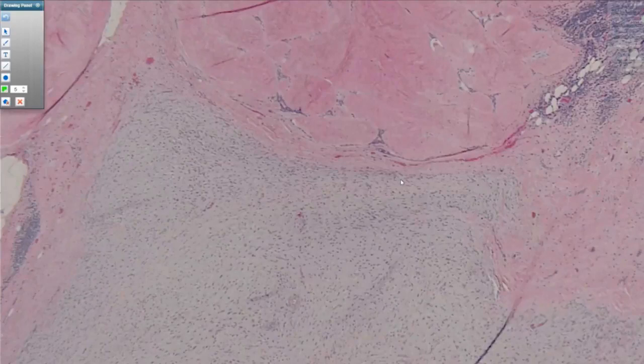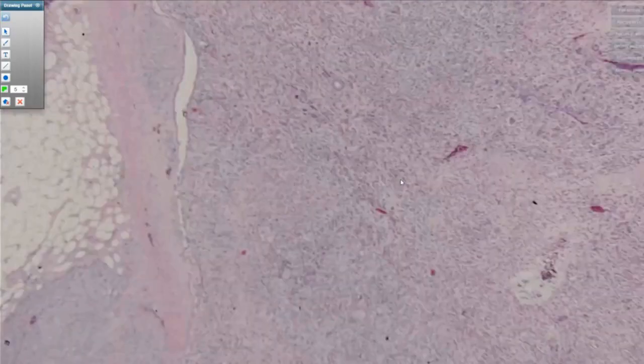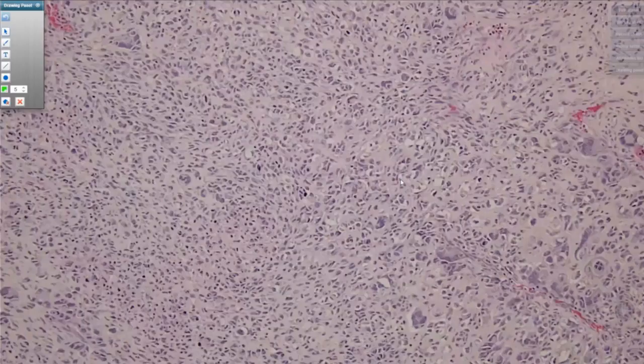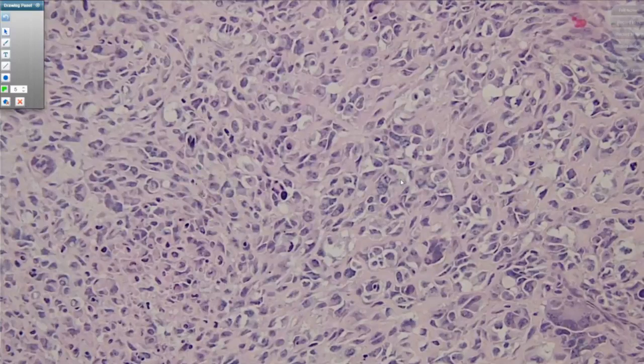This next example of a malignant spindle cell tumor here on excision, you just see sheets and sheets of high-grade pleomorphic cells. This is in contrast to the last case where the cells were more uniform and moderately atypical. But here we see these cells, which you could even argue look epithelioid in areas. We have multi-nucleation, atypical mitotic figures. Again, these are giant malignant cells.